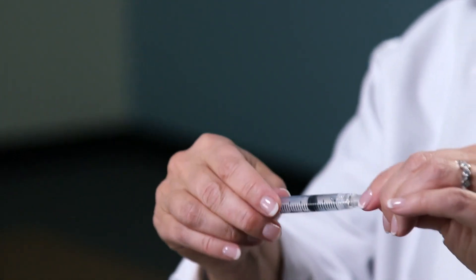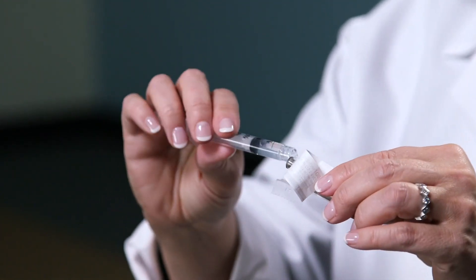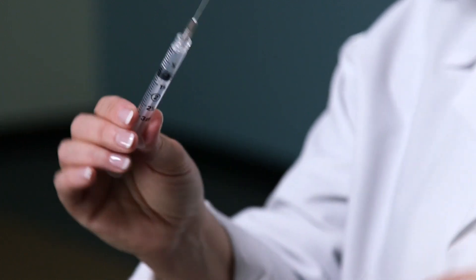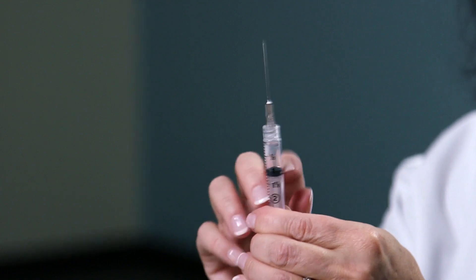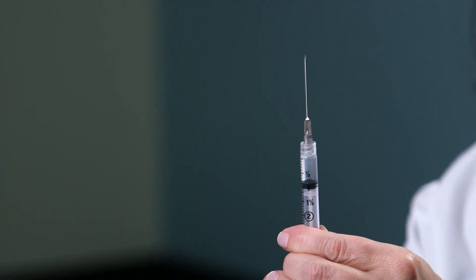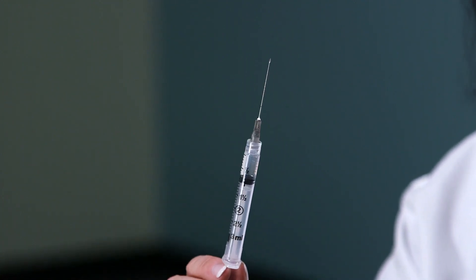Cap this needle and remove it, and get another 1½ inch needle, or prescribed size, for intramuscular injection. Tap the needle, then press on the plunger until you see a droplet form at the tip. You're now ready for your intramuscular injection.